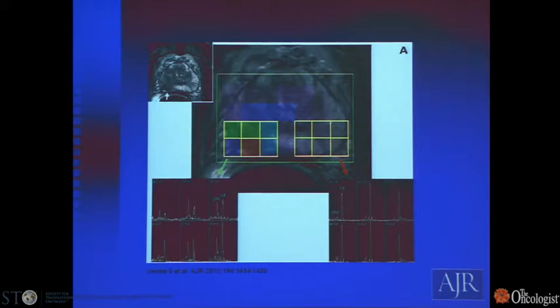In a normal prostate gland, the citrate peak is relatively high compared to the choline, but in the presence of cancer or tumor, those ratios change and the choline peak becomes relatively large relative to that of citrate. So we're seeing the difference in spectroscopic signature, comparing the abnormal cancer spectroscopy on the lower left with the more normal spectroscopic signature of prostate on the lower right.